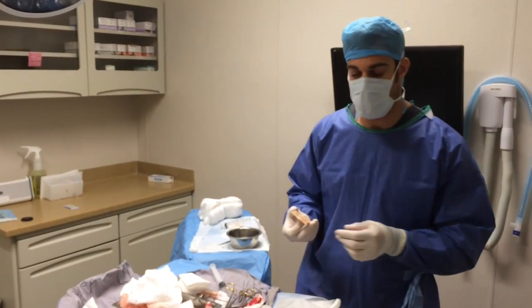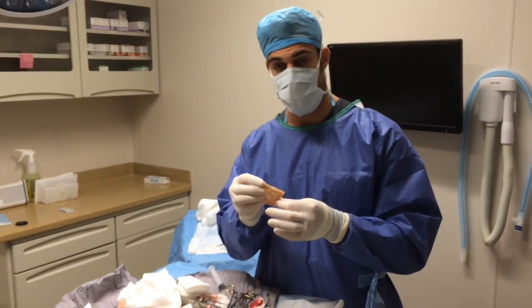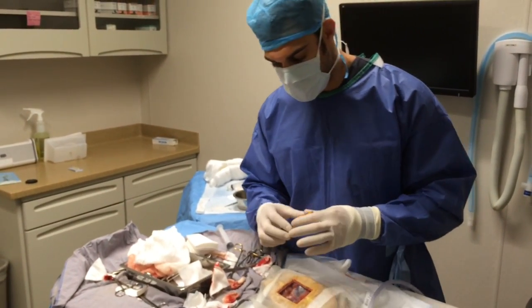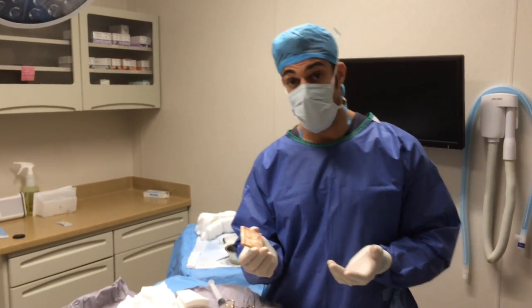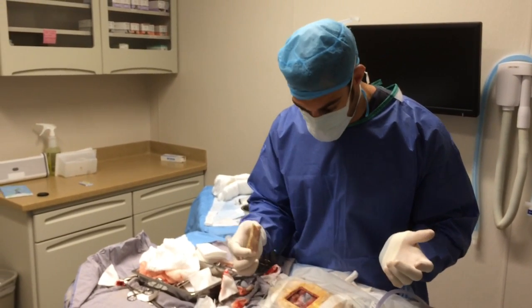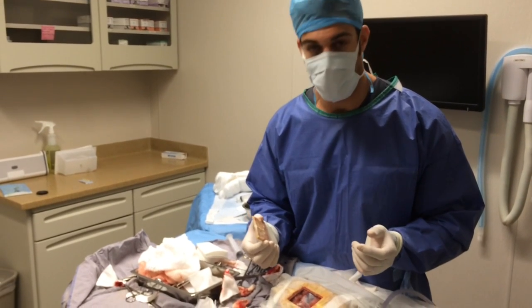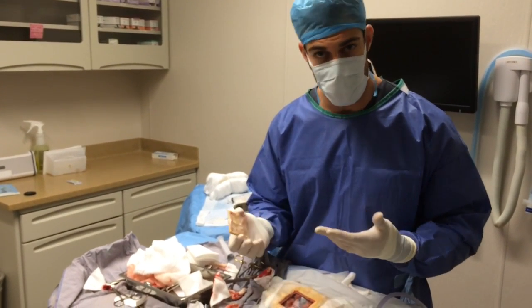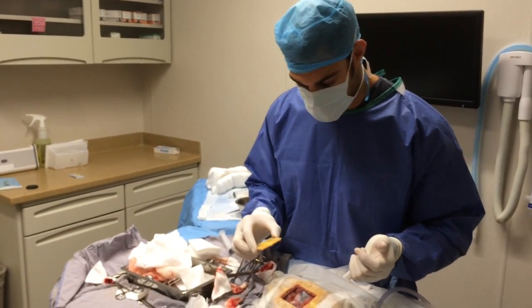We just got the stones out of the tortoise. Now we're actually going to replace the shell, or plastron, back where it belongs in this little window right here. It's pretty nutty that you can actually completely sever and separate a piece of tissue and then it lives — it almost always lives in these guys when you put it back on, which is pretty neat. We use epoxy and fiberglass — some fun stuff you don't typically use in veterinary medicine. Tortoises and turtles are what give us that option.